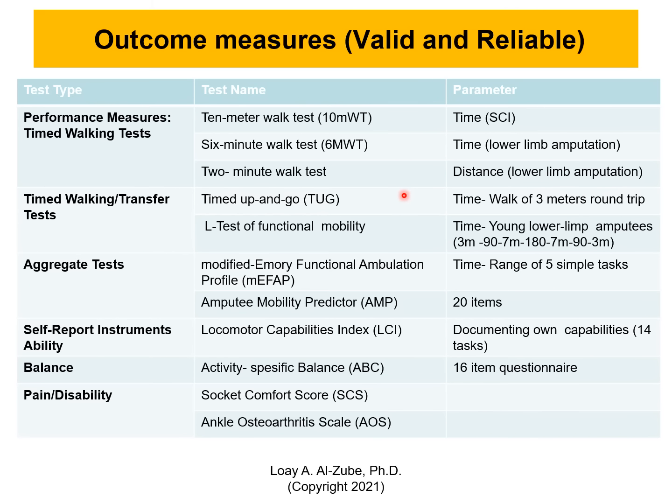That's how much distance the subject is moving in 2 minutes. That's what we're looking at. And then you have the walking transfer test. So you go timed up and go. This is a test where the subject will be sitting on a chair, and they will measure the time when they go up and move. And we take a lot of things for granted. If someone has a lower or upper prosthesis, standing up is a very, very complicated task for them.